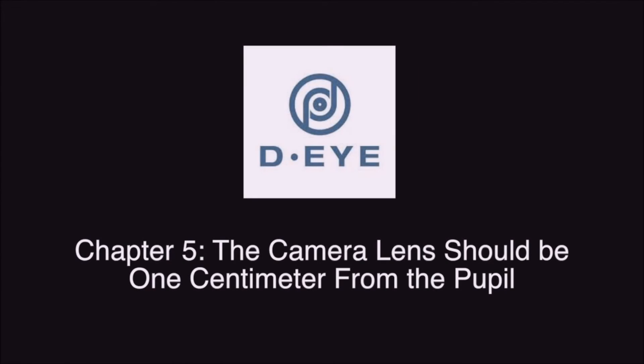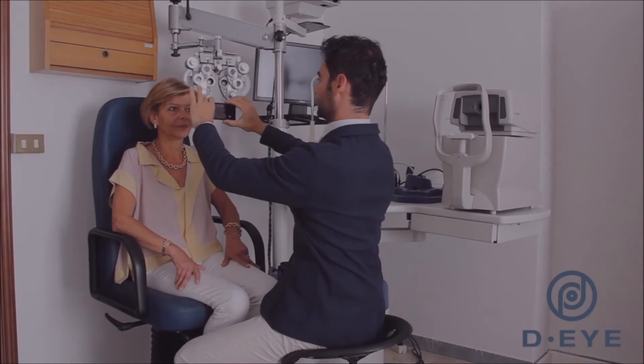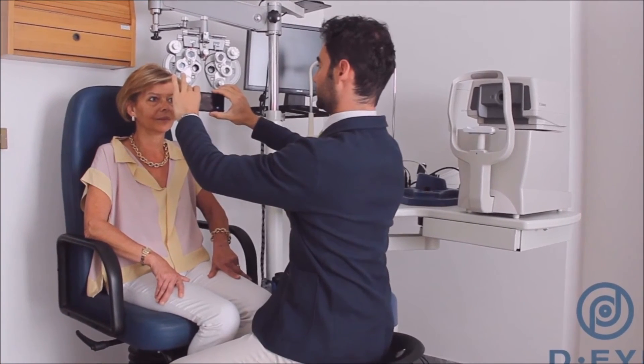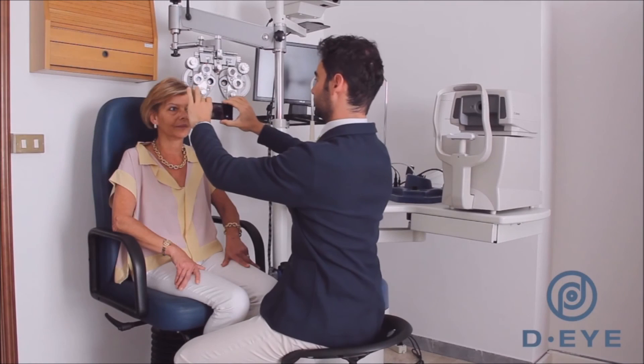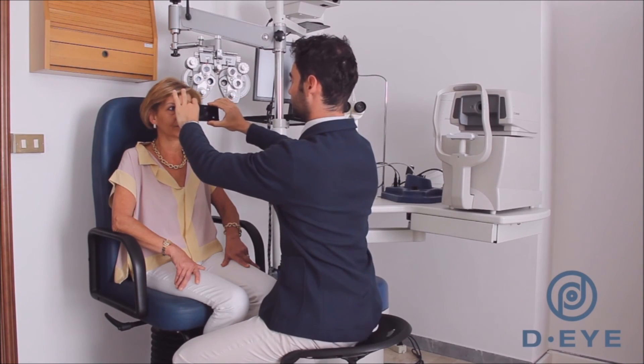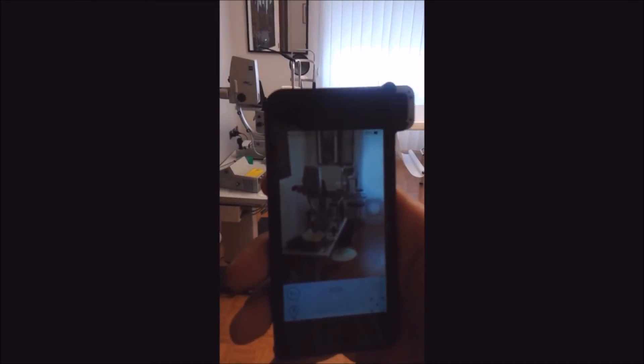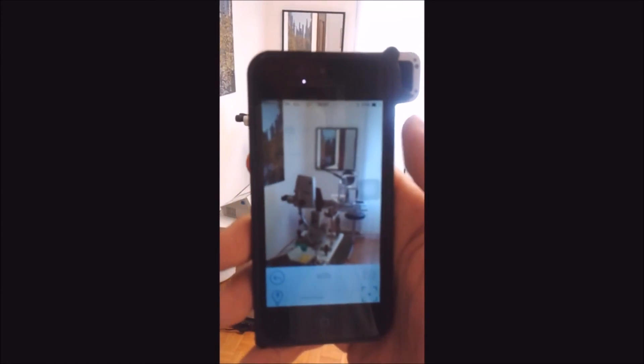Chapter 5. The camera lens should be 1 cm from the pupil. Often, first-time users are too far away from the pupil — too far away can be 3 to 5 cm, far enough that you will not see much of the posterior. So don't be shy. Move the lens in as far as possible without touching the eye so all you see is the outer edges of the iris on the outer sides of the screen. The closer you are, the greater the field of view — just like looking through a keyhole, the closer your eye is to the keyhole, the more field of view. As you get used to watching and waiting for the focus to settle, you will get constantly better scans. Training yourself to move the lens in as close as possible to increase the field of view is also a very important learning curve.